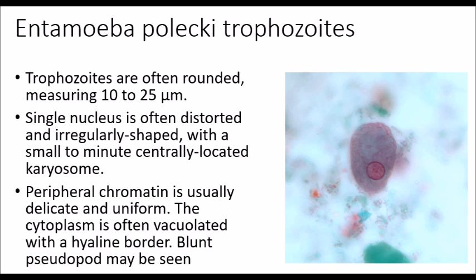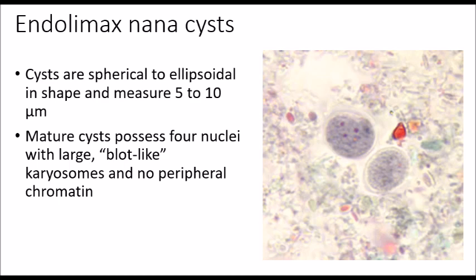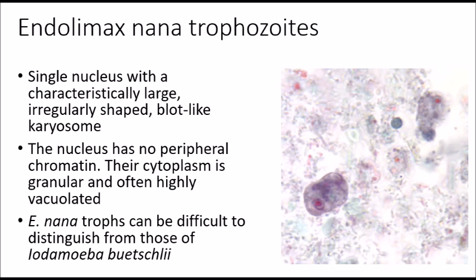Endolimax nana cysts are spherical — hence the name nana — and small, measuring about 5 to 10 microns. The mature cysts possess four nuclei with large, blot-like karyosomes that lack peripheral chromatin. The Endolimax nana trophozoites have a single nucleus with a characteristic large, irregularly shaped, blot-like karyosome. The nucleus has no peripheral chromatin, and the cytoplasm is granular and often highly vacuolated. E. nana trophs can be difficult to distinguish from those of Iodamoeba buetschlii.